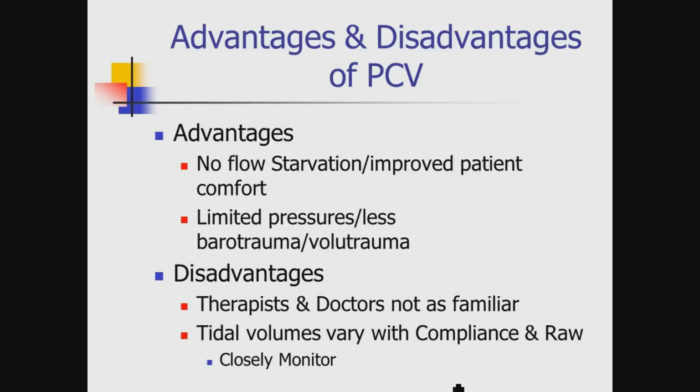So what's the good news about pressure control? As I was mentioning earlier, 20 years ago everybody was volume ventilated in the adult world. Is that fair? And pretty much everybody in the neonatal world was ventilated with pressure. Now we've flipped. Neonatal ventilation is becoming much more volume oriented, and in the ICU we're being much more pressure oriented. 10 years from now, it'll probably flip back again, so who knows what'll end up happening.